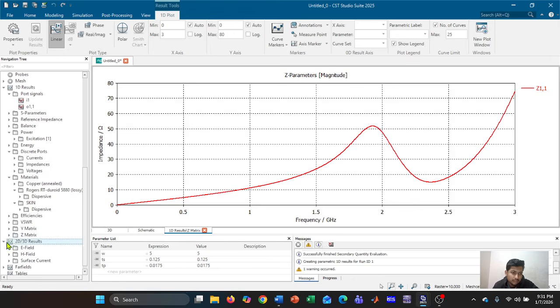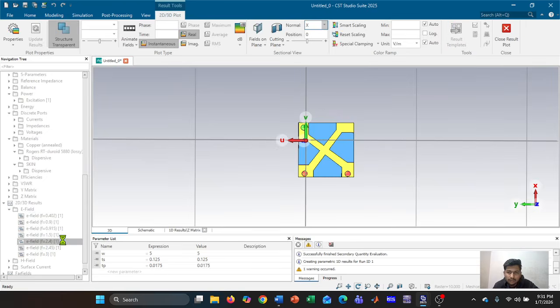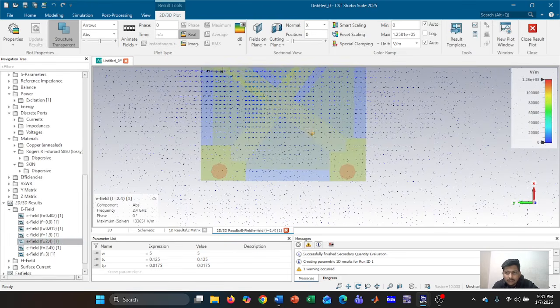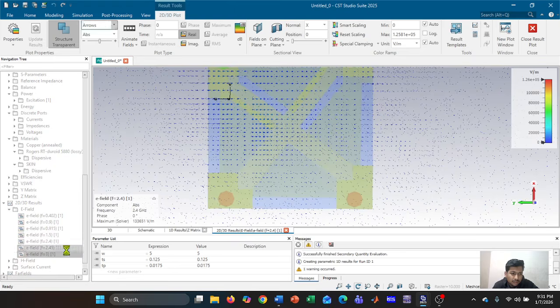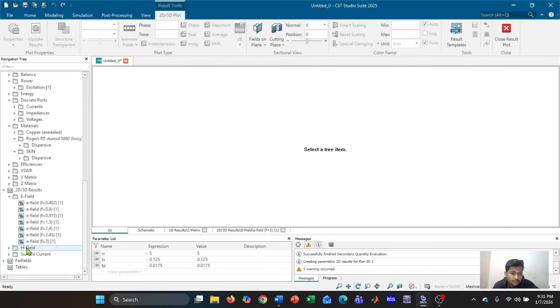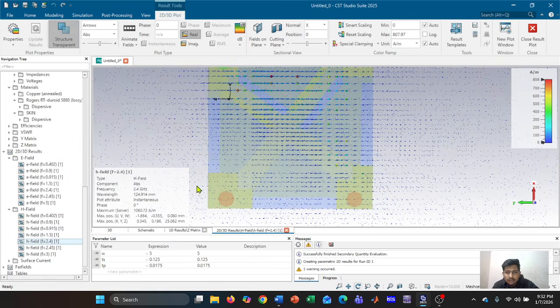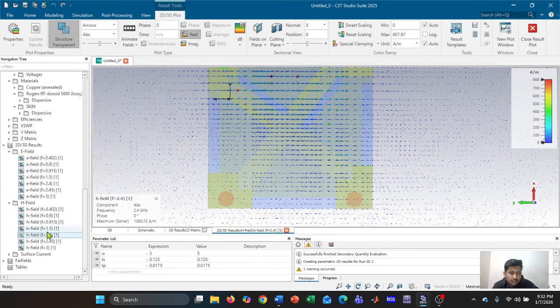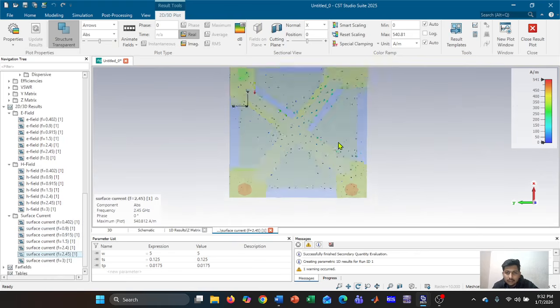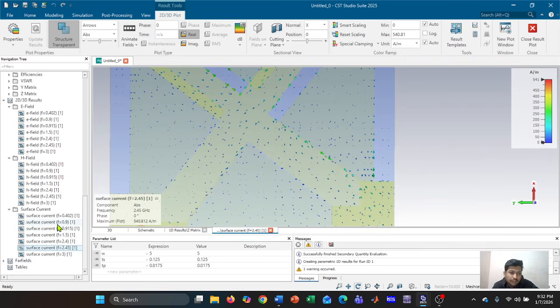Now if we need to see the electric fields for frequency 2.4, electric field directions. For 3 gigahertz, it's like that. The H field for 2.4 gigahertz, this is the H field for 2.4 gigahertz, and the surface current for 2.45. You can see the direction of current flowing, in amperes per meter.